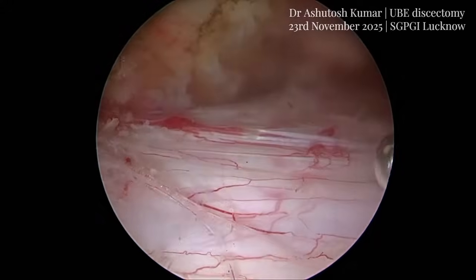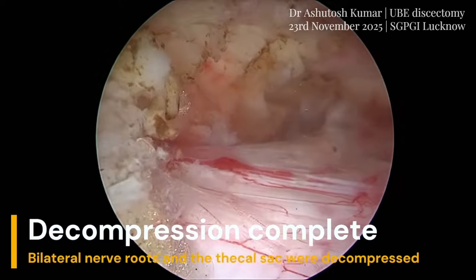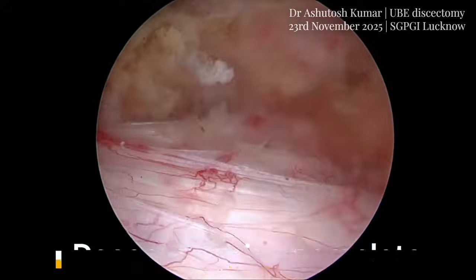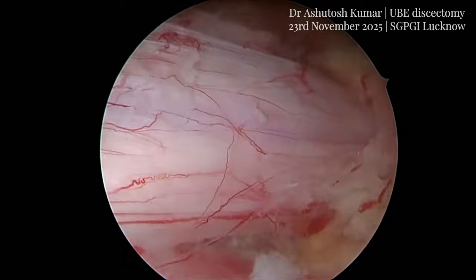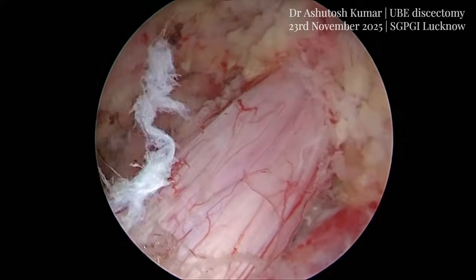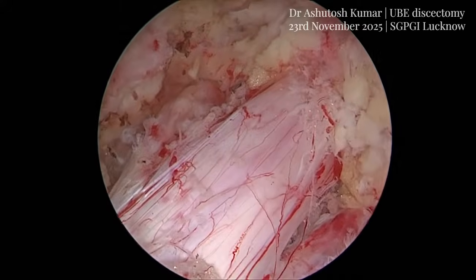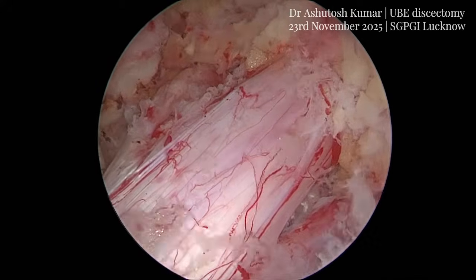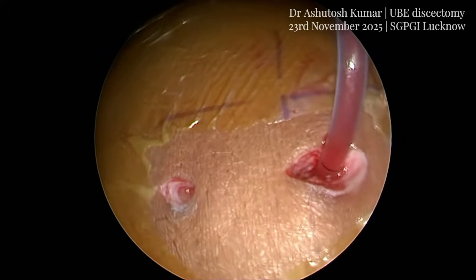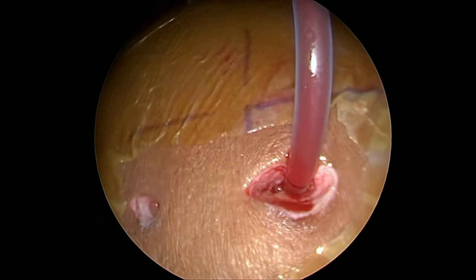The thecal sac is now completely decompressed. Also, the contralateral traversing nerve root and the ipsilateral traversing nerve root can be seen completely decompressed. Thus, the technique allows comprehensive decompression of the canal as well as bilateral lateral recess through a unilateral approach. The entire procedure was performed through an 8 mm working port along with a small stab incision for the viewing port.